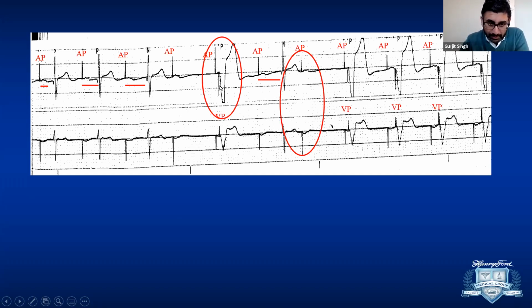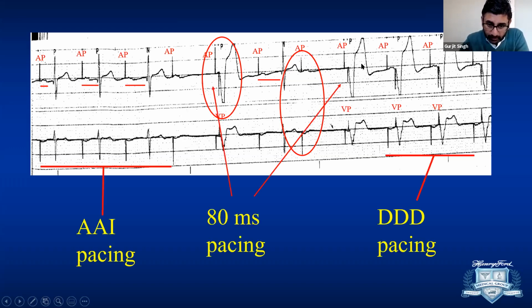So remember, we talked about last time, as Dr. Bordino also explained, this is a hallmark for a Medtronic pacemaker in MVP mode, that this ventricular pace signal comes after an AV delay of 80 milliseconds. This is different from safety pacing, which we discussed last time, which happens when you sense something on the ventricular channel at the time the atrial is pacing. That safety pacing is usually 110 milliseconds. So this is MVP working. You see 2 out of 4 atrial complexes losing conduction, and the pacemaker switching to DDD mode. Okay, so this is MVP in action.